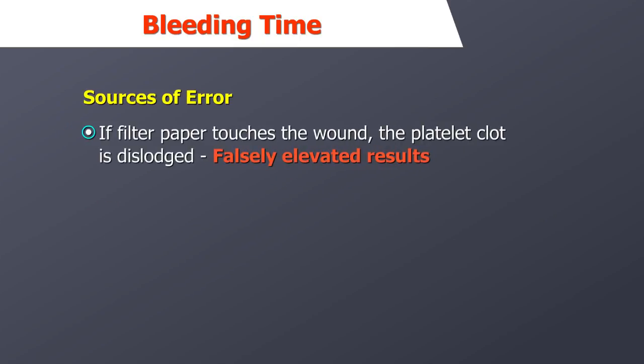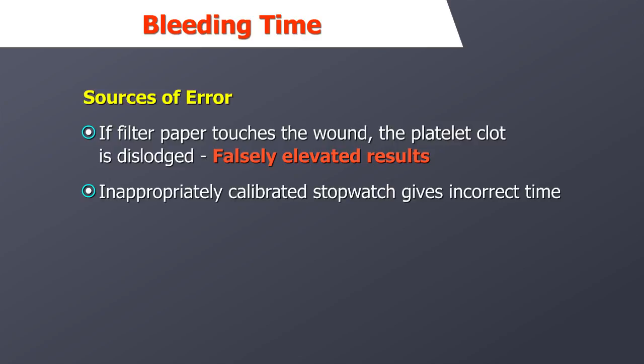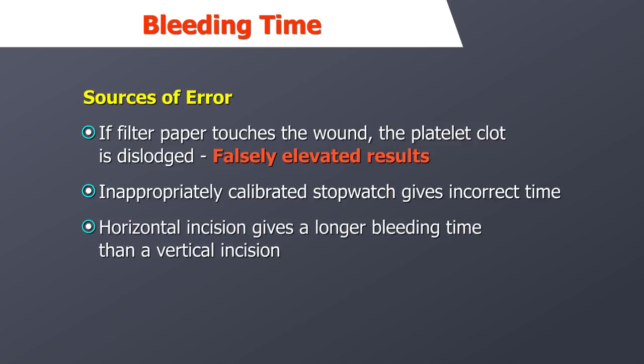If you allow the filter paper to touch the wound, the platelet clot may be dislodged, causing falsely elevated results. If the stopwatch has not been appropriately calibrated, it may keep incorrect time — stopwatches should be calibrated on a regular basis as part of the quality assurance program. The direction of the incision should be consistent: a horizontal incision gives a longer bleeding time than a vertical incision.